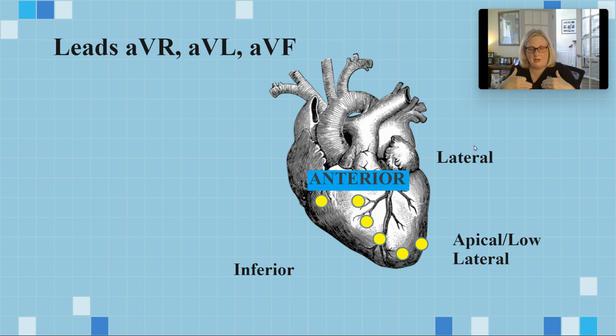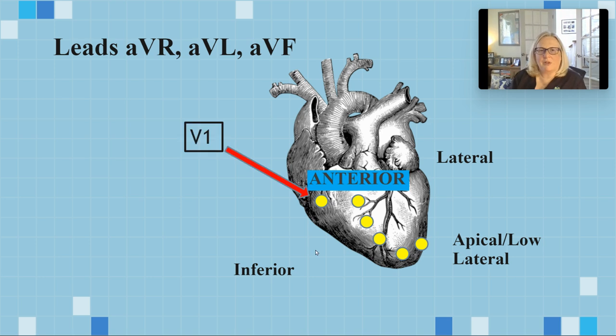2 are here, and they work their way down through that Nike swoosh up into the armpit, right? And here they are right here. So this is basically where it's kind of placed on the heart. Your heart is center chest, but pointed to the left, so it's more going to be looking like this. So let's take a look at V1 first. V1 right here and V2. So V1 and V2 are there, and they are clearly anterior on the front of the heart.